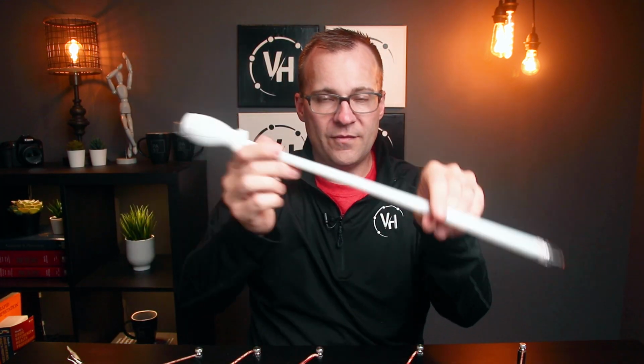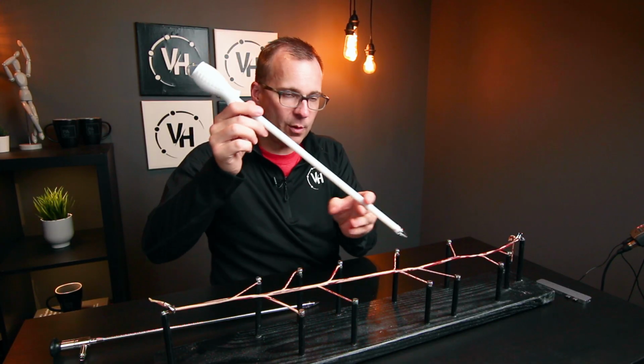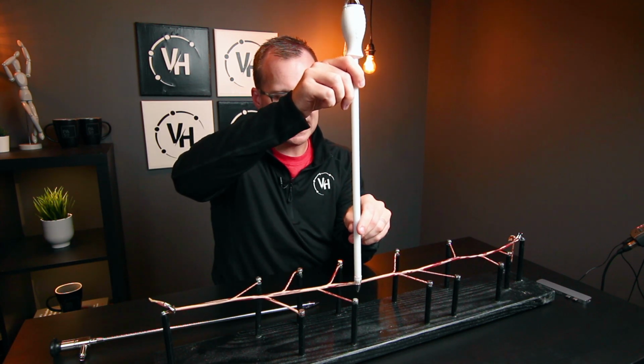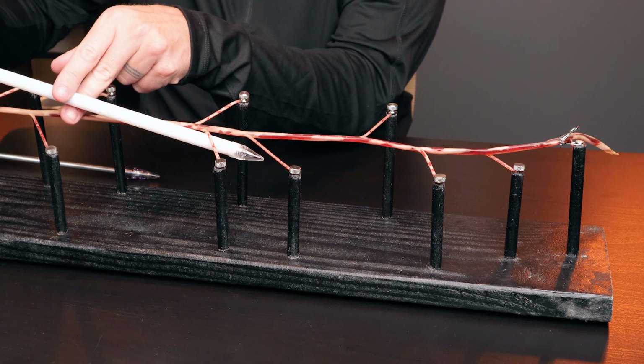So we don't want to find the vessel all the way up here and then start to work backwards or anything like that. I mean, it's possible. In theory, you could do it. But we want to get that scope right down onto the saphenous. Oh, here's my saphenous. I'm going to drop that down, and I'm going to start my posterior dissection.